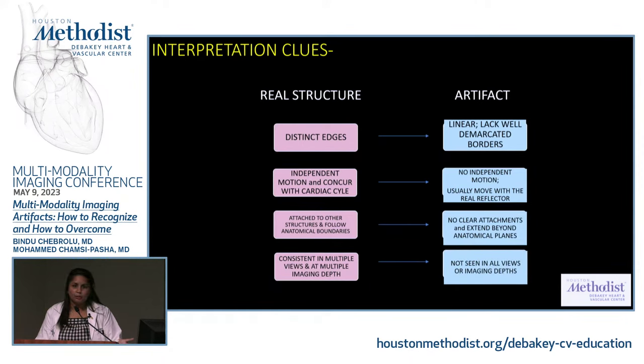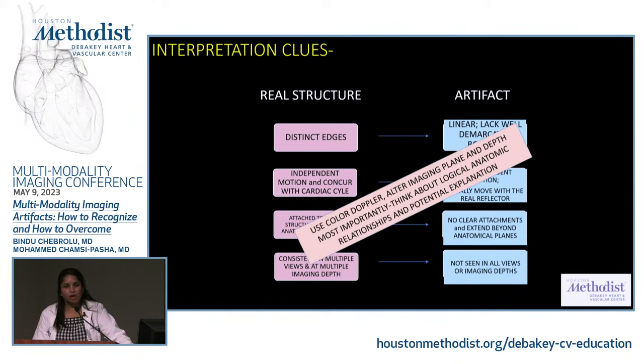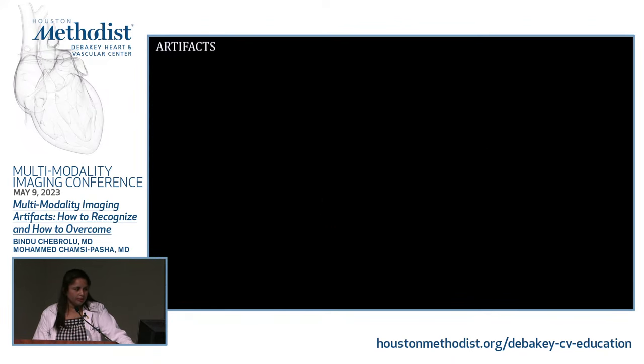Artifacts can sometimes disappear, right? Just based on how you do the imaging. So important thing to remember, and again, put everything in the clinical context. Make sure you're looking at the clinical context as well.